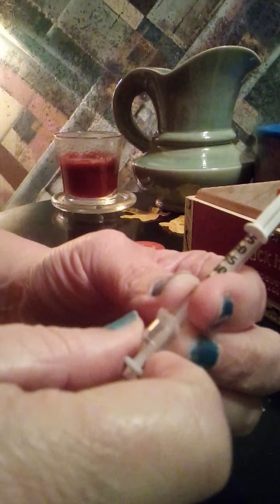It's very hazardous. I was very lucky that all of it just didn't spill out on the table and, you know, lose it. Have it wasted. I don't want to waste anything. So that is extremely hazardous. And also, it puts you at risk of having high blood sugars because you don't have a good delivery system.